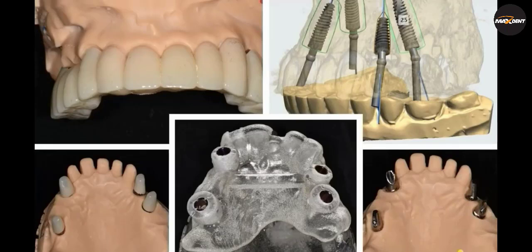The use of computer-guided planning enabled the preparation of all the components prior to surgery, resulting in a swift and accurate surgical procedure and simplifying the completion of the temporary bridge. The considerable saving in chairside time far outweighed the preparation of the planning stage. Ultimately, the patient benefited from a short treatment protocol.